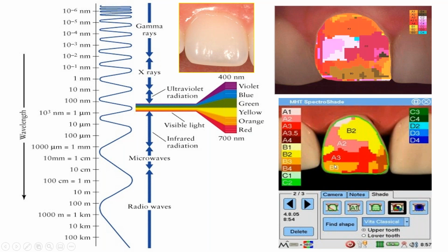And we're talking about B3 here really as the incisal of B3, because everything is modified, everything is set towards the VITA gold standard as far as the translucency, that chroma, that hue specific to that shade tab. So when we say close to, no one today is really going to do a lot of minute powder layering to build up a little B2 here, A2, A3, B3, plus consider the translucency as well. So what we do here is come up with a general close-to-basic shade that we select, and then hope that it blends in with the adjacent dentition if that's what they have.